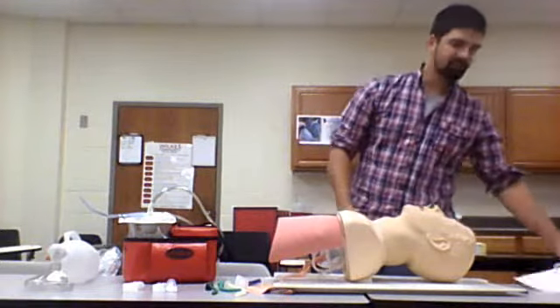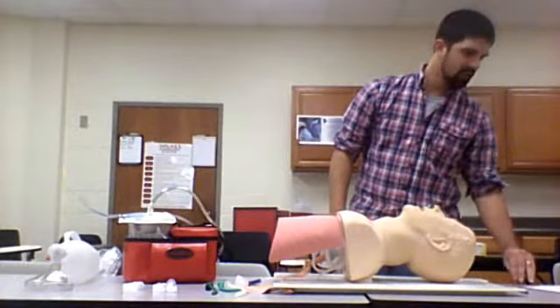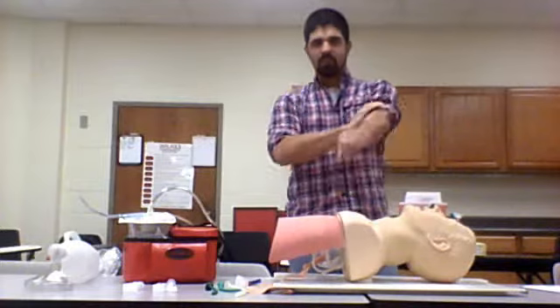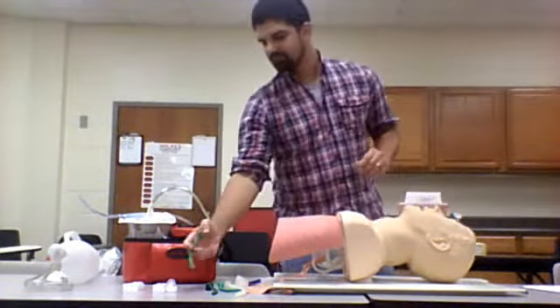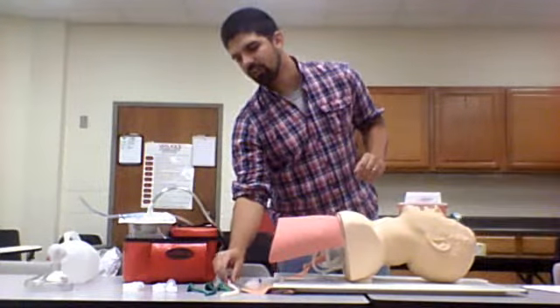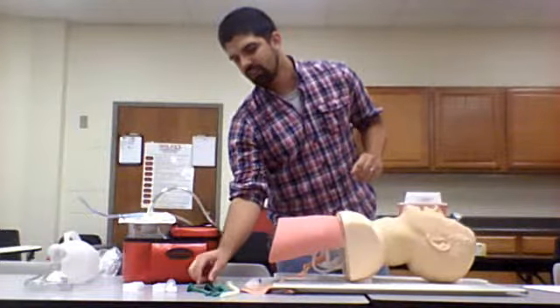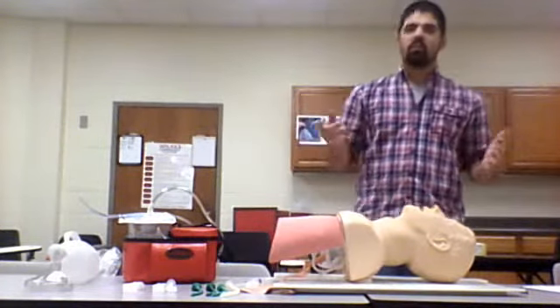Today we're going to be doing a skills presentation for the methodology course. Today we're going to be talking about the BVM ventilation of an apneic patient. So in this skill, what we have is an apneic patient, someone who is not breathing, but they do have a pulse in this case, and we want to control their airway.